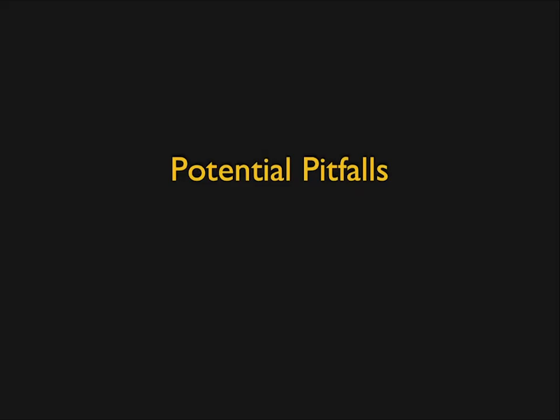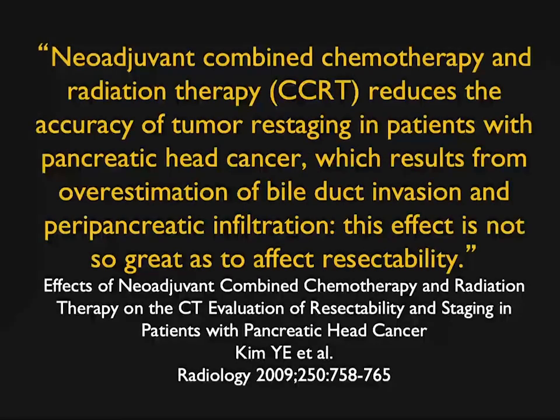And I thought I would do a little bit on potential pitfalls. Now, I mentioned before, obviously, the biggest pitfall is missing the lesion. But there are other problems we have.